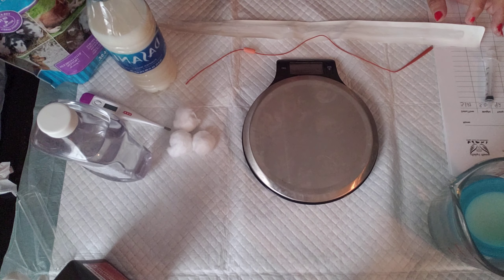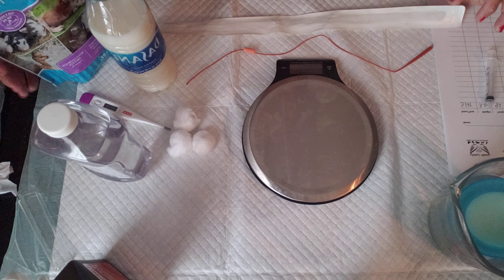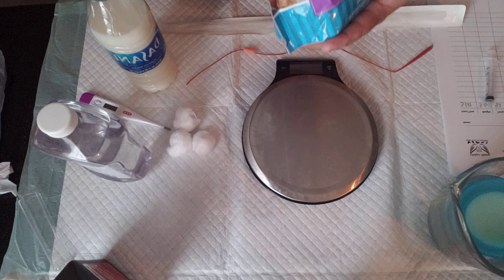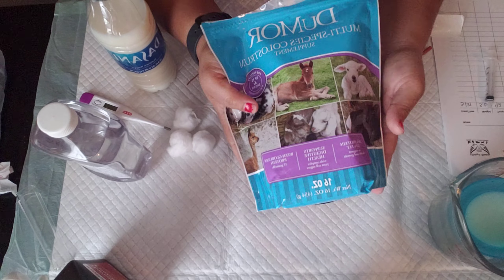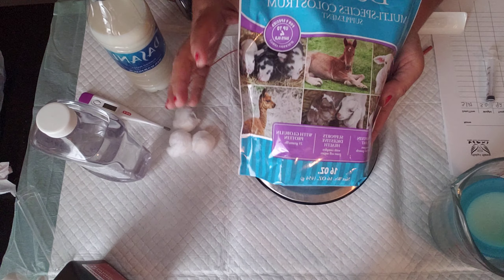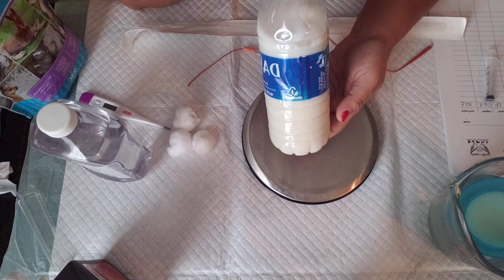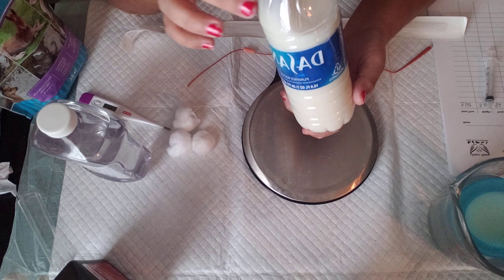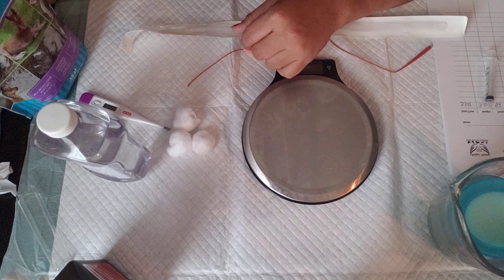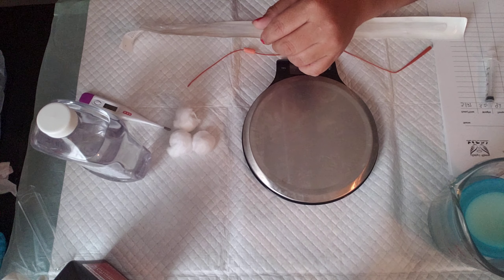Alright guys, so I'm going to try to do a video today about tube feeding day-old kittens. I couldn't find any feline colostrum, so we're going to be using this, which is not necessarily recommended. Instead of doing the half a cup, I did a little under half a cup, and then just a full bottle of water. I always try not to use sink water — purified water is what I try to stick with.